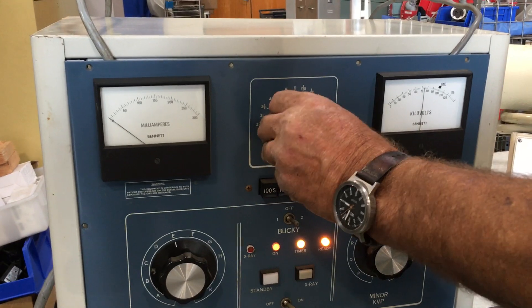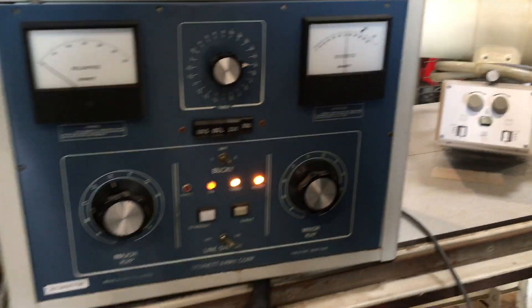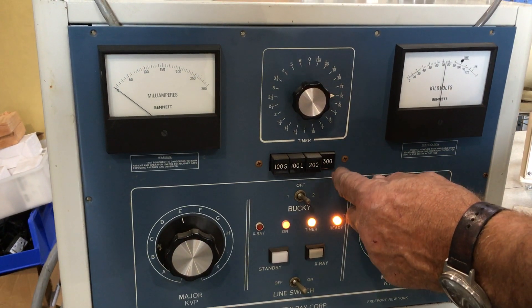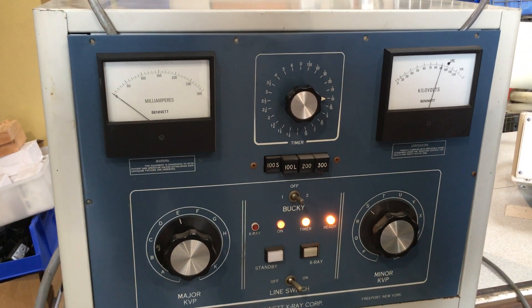This is your timer. Set it for whatever time you wish for the x-ray. This is how you determine where your MA is going to be. These are all large MA spots, and this is a small MA spot.